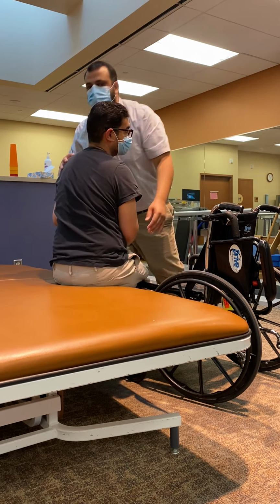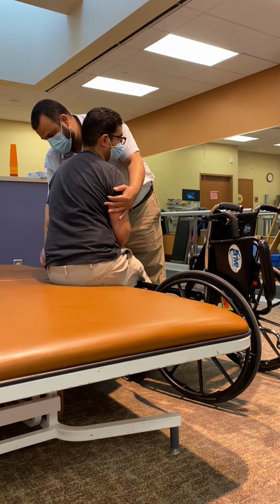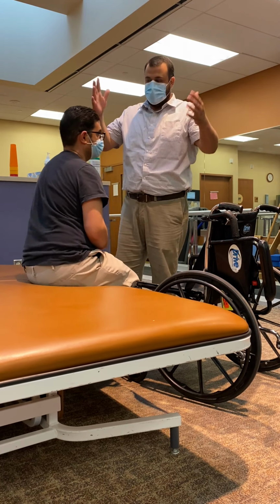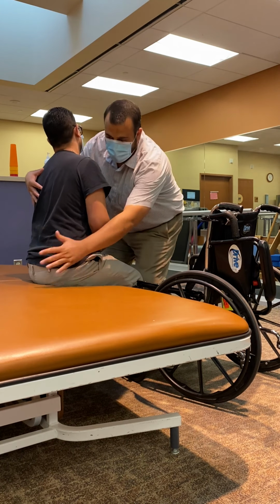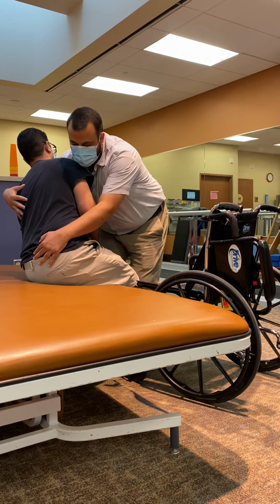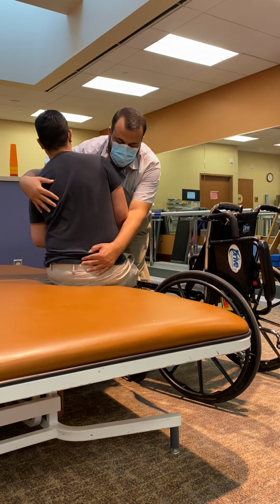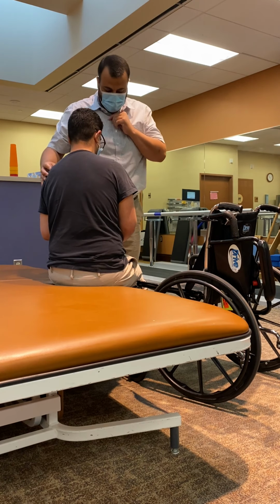Great job. Again, just to show you that, let's go forward a bit here. I'm going to put one hand on the left upper trunk, as you know, one down here. Lean please toward your left side and advance your right side forward. Great job. Fix your feet.